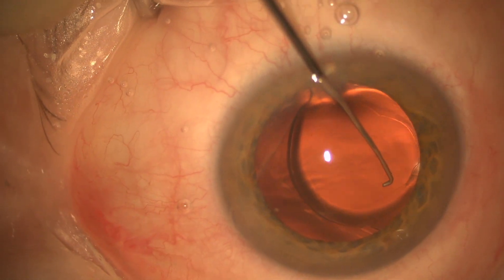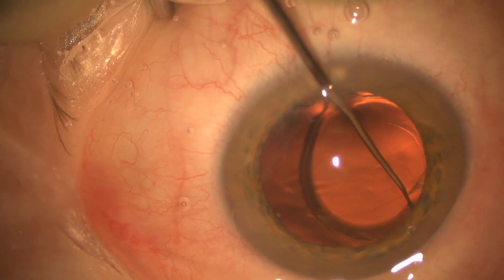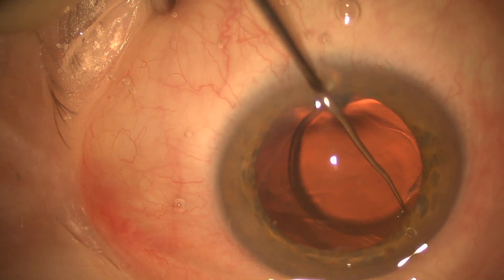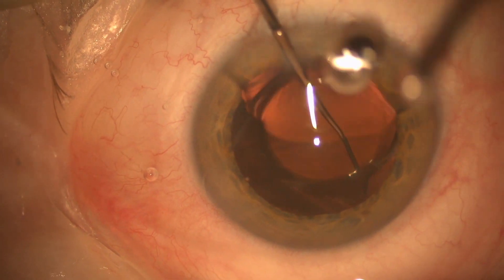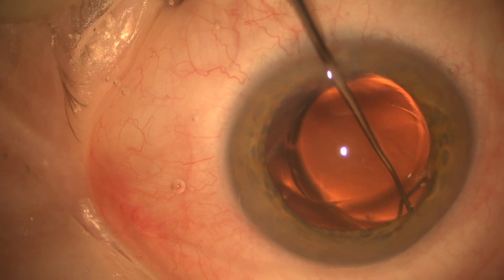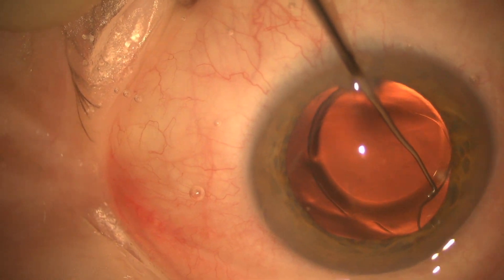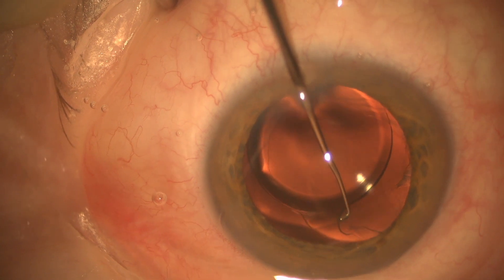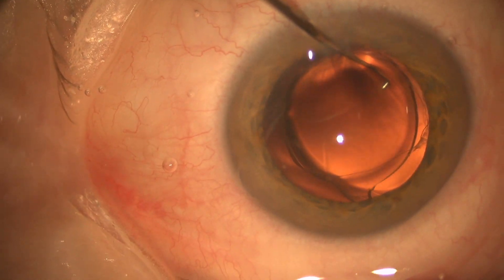Here we're going to use a Sinskey hook to inspect the haptic that was dislocated nasally. We want to make sure that the haptic isn't actually broken off. I was pretty sure it wasn't because I did the primary surgery, but still didn't have a great reason why the lens was so dislocated inside the bag. And you can see there that the haptic is totally fine.